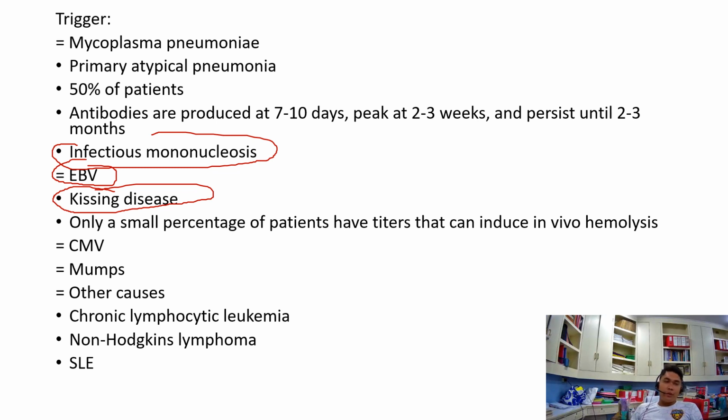Only a small percentage of patients have titers that can induce in vivo hemolysis, or hemolysis inside the blood vessels.